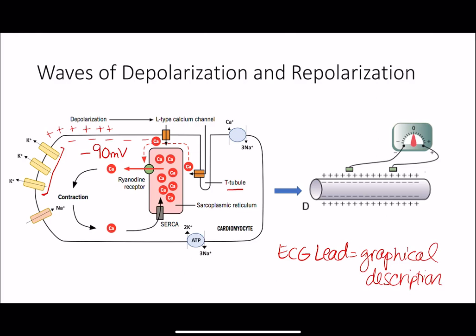So in your notes, you might want to draw this little kind of EKG recording device here. And notice it has a negative, a neutral, and a positive on the dial. And this electrode that comes out, the negative electrode, is called your reference electrode.